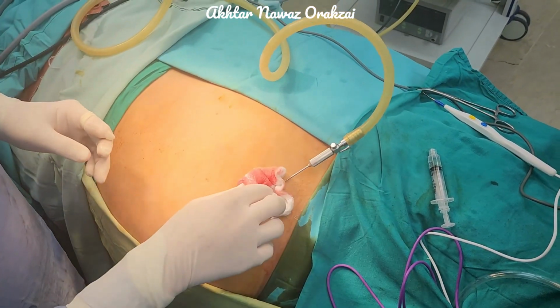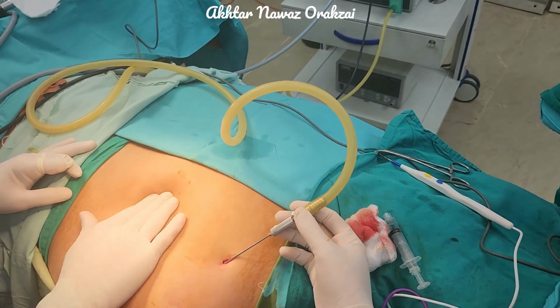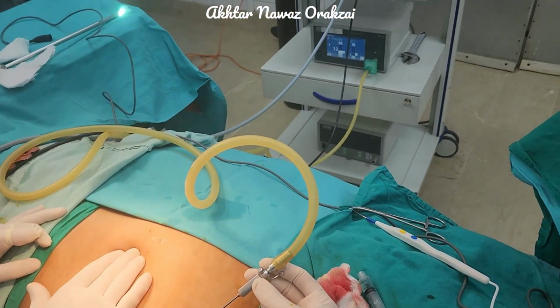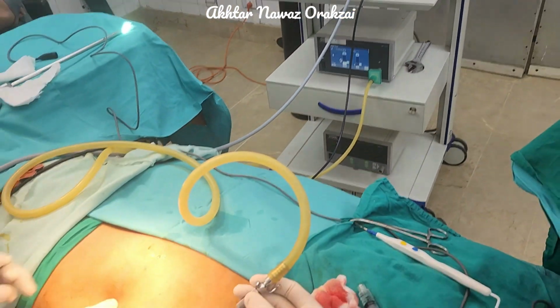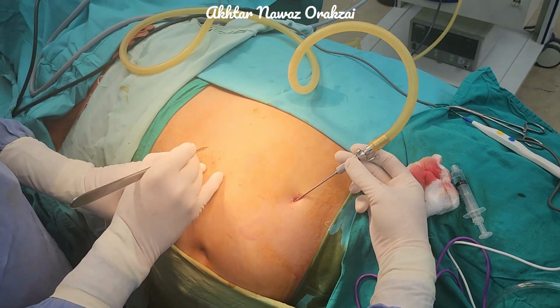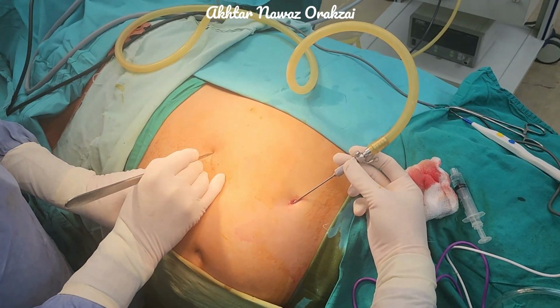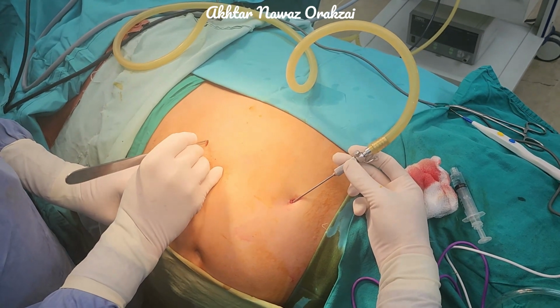So the pressure is now around 12 millimeter of mercury, and now this becomes the tip of the 9th rib, and this is one finger breadth. So we will put in the optical port here. We make an incision in the skin, and this is usually the 10 millimeter port.